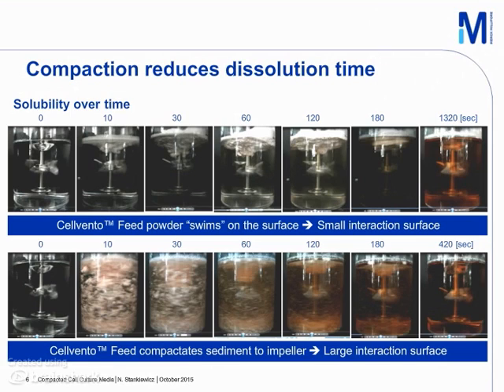If you are wondering about the residual medium on the top of the liquid, this is because the solubilization was performed in 80% of the final volume, and water addition will wash the remaining medium into the mixing vessel.